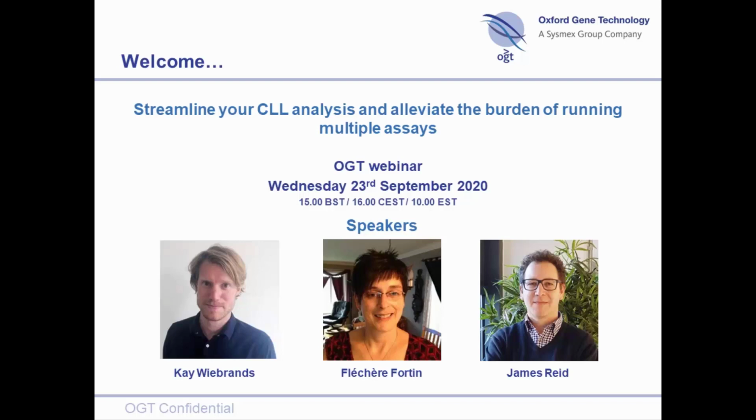Well, to a certain extent, certainly, yes. We have developed in the past plugins to accommodate such requests from the customer's side. So, as you said, you could have something upstream. So there could be a laboratory information management system with, say, sample information, sample tracking, and so forth. We'd have to know how to access that, but then that could be done, and then that information could be linked to the sample IDs of our sequencing runs within Interpret, and so that is a full integration, let's say.